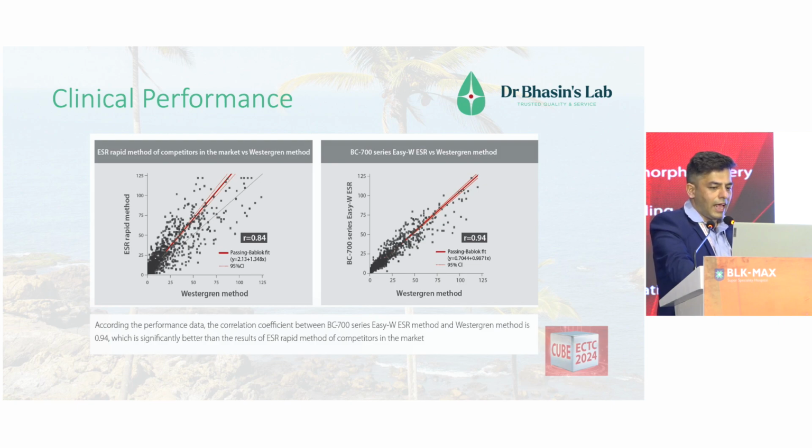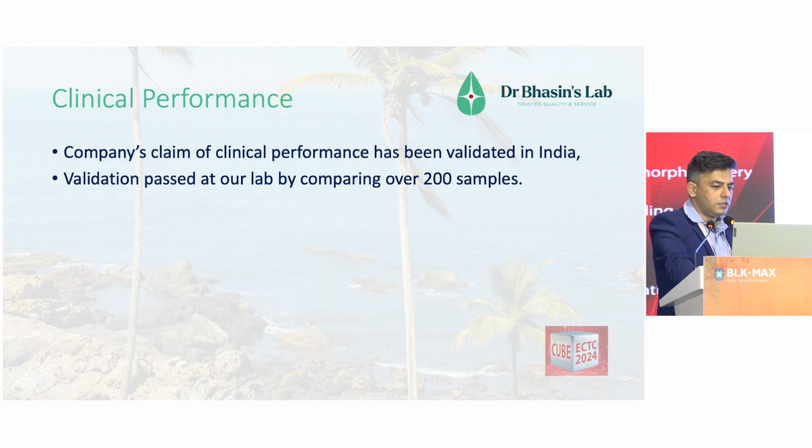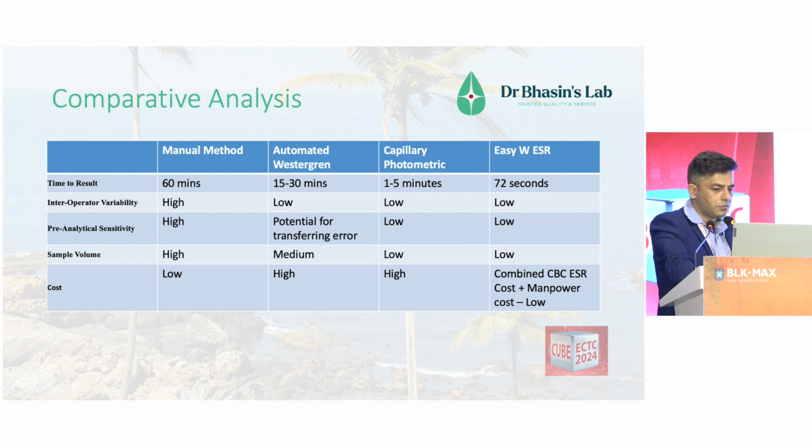Clinical performance, as per the company, has a 0.94 correlation. However, the same claim was tested by clinical validation by Dr. Kunal in India. 2 years ago, when we brought this and started reporting, we had done our validation with over 200 samples and we had found complete correlation of almost all values.